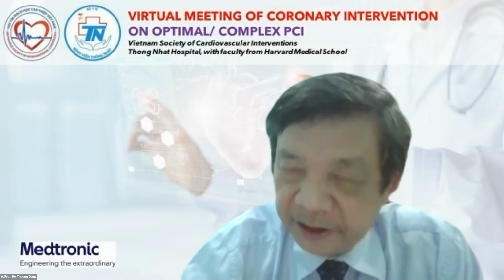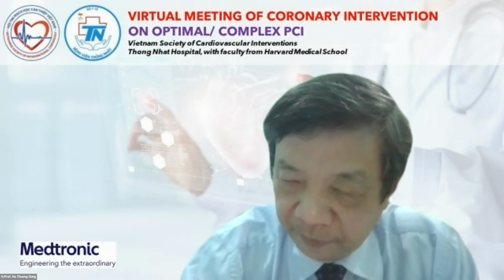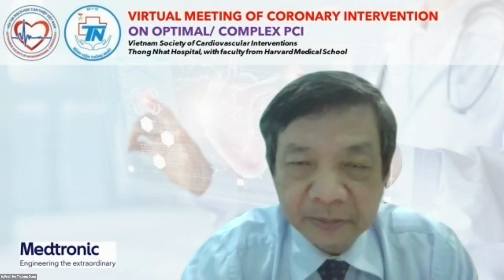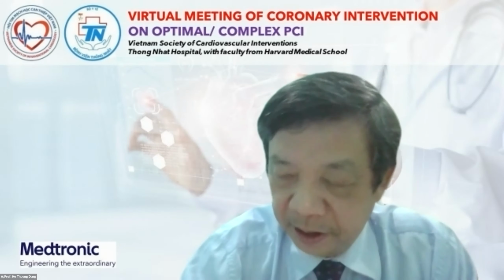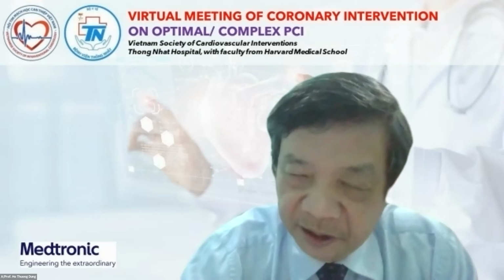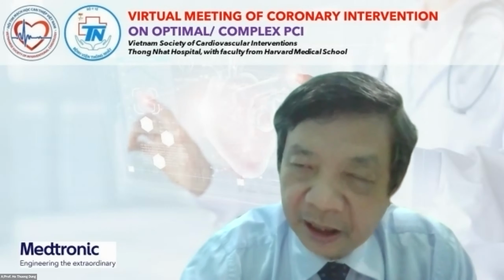And in in-stent stenosis, the OCT gives very excellent image recording, because I have used the power-up technique, and I have many cases of in-stent stenosis. In some cases I used IVUS, but it was not clear. Very difficult to evaluate neo-atherosclerosis or the mechanism. But when we use the OCT, we can see neo-intima, neo-atherosclerosis, neo-calcification very clearly, and we can see multiple layers of the stent.